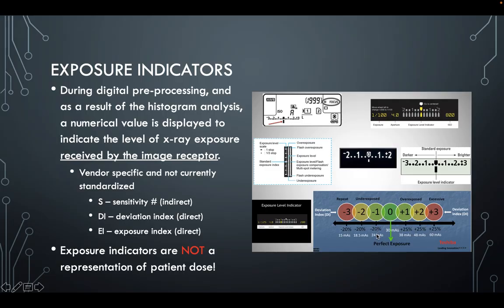And honestly, from what I have been told by multiple sources, though I have not found this in a textbook, we kind of want to be around a -1. We want to be just a little bit below 0. And that's following ALARA, as long as my image is not showing excessive mottle.